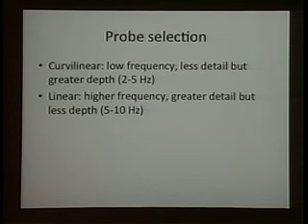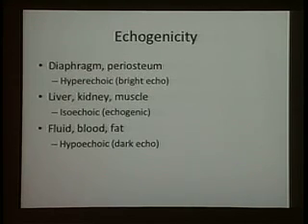You want to have high resolution. There are surface structures; you're looking at the lung at its interface with the pleura. So you're going to use both probes to have imaging of the lung. And again, the lung is basically an organ that doesn't transmit sound waves, except if it's filled with water. And you take that to your advantage when you're making your assessment.